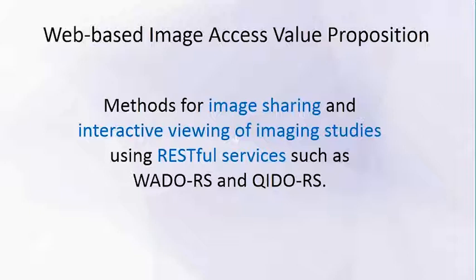There's already another profile that was published earlier, called Web-Based Image Capture, that uses STOW-RS. That lets you use RESTful services to push DICOM objects from the sender to the recipient. And this profile complements that by allowing you to use RESTful web services to query and retrieve.